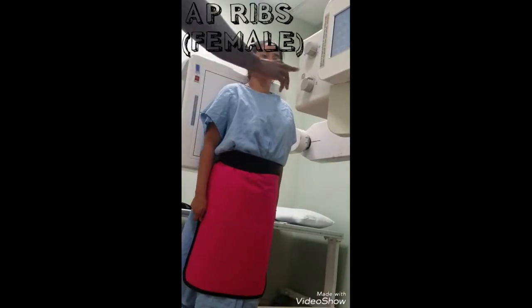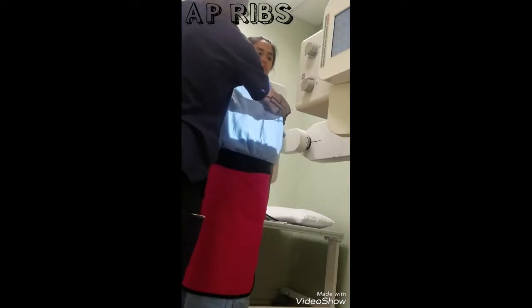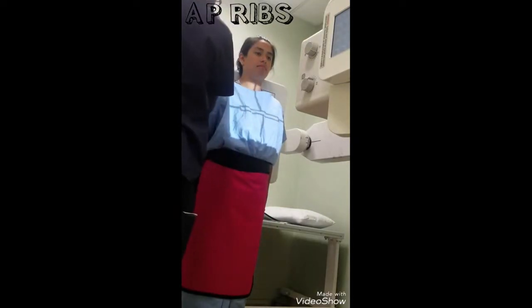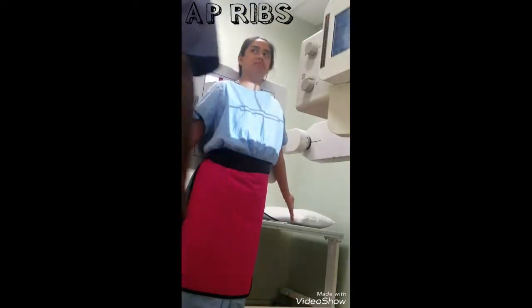The following patient I will describe is a 78-year-old male who had complaints of chest pain in the right thoracic region, in which his physician had requested a rib X-ray examination. Protocols at this site are seen above with a female patient reenactment.